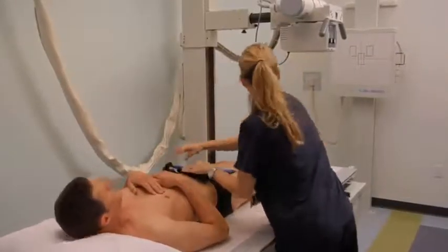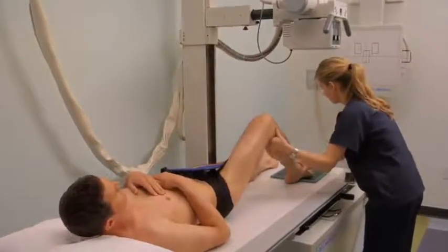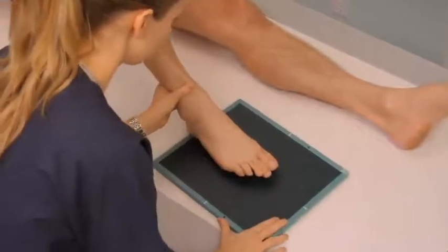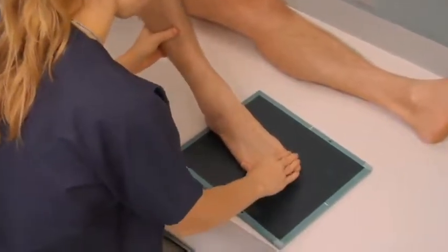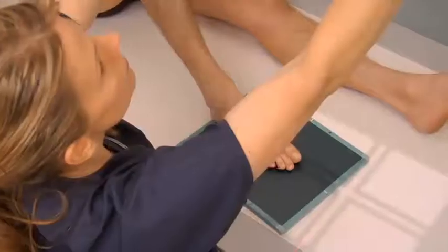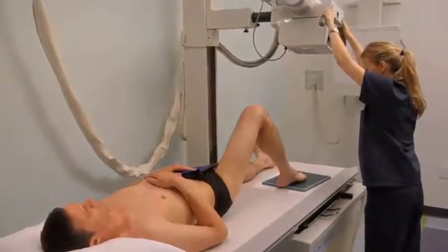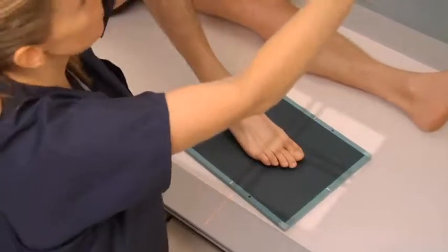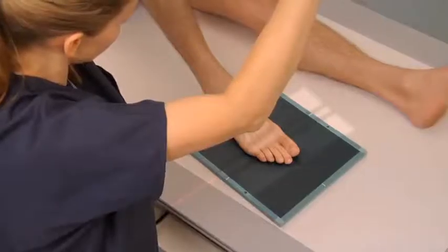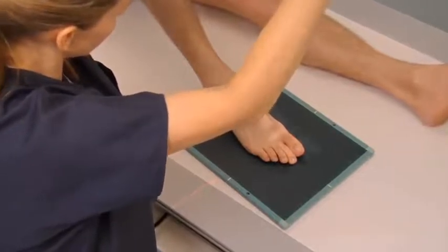Place a protective lead shield over the patient's pelvic area. Flex the patient's legs; alternatively, the unaffected leg may also be fully extended. Align the plantar aspect of the toe with the center of the cassette. Turn on the collimation light and angle the central ray 15 degrees towards the head. Center the central ray to the affected toe's metatarsophalangeal (MTP) joint. Collimate to include the phalanges, MTP joint, and distal metatarsal of the affected toe.